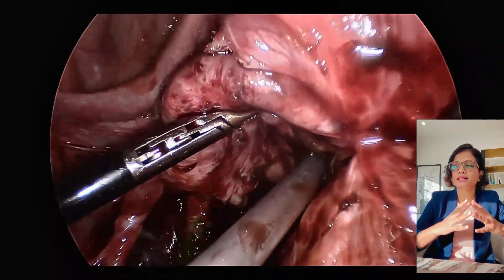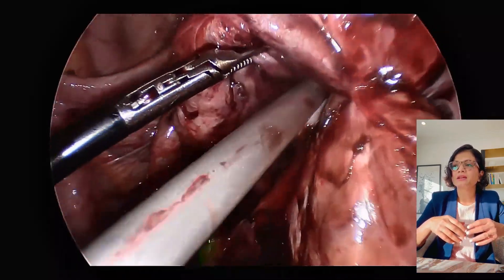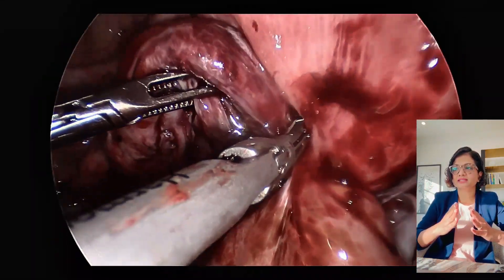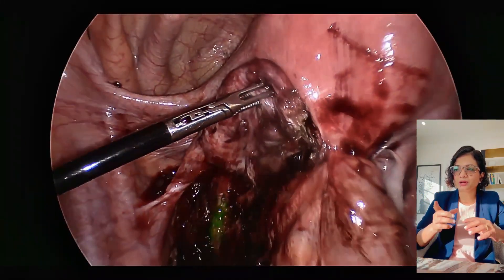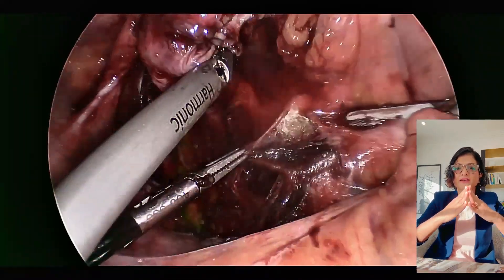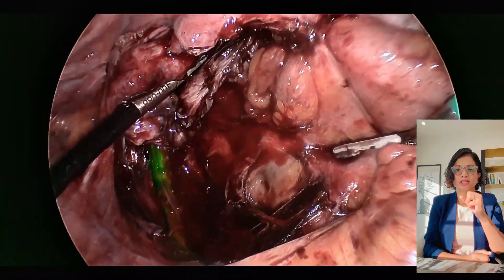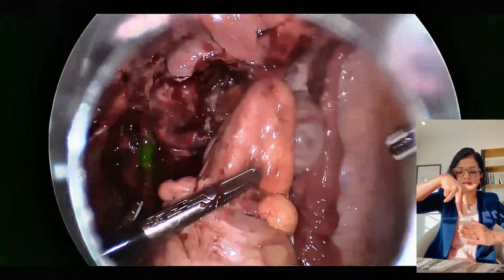The classic approach when you have bowel adhesiolysis is you need to narrow down the adhesions right at the center. When you do that, you have to open up the pararectal spaces, lateralize the ureter, and then all that's left is your bowel. I can see a few adhesions between the ovary and the bowel, so I'm trying to remove that as well. What I want to achieve is this inverted V-shape appearance with the bowel, so most of it is isolated to the nodule connecting the rectum and the uterus — that way I can go right on top and cut it.